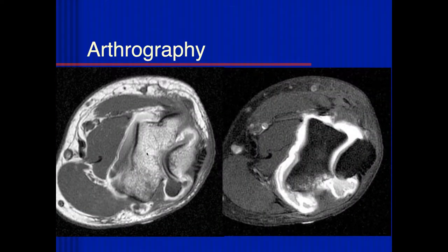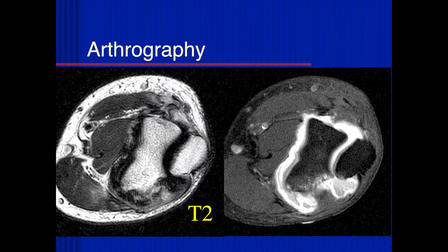This shows an arthrogram. We rarely do arthrography of the elbow, and in my experience I would rarely do arthrography just about anywhere. Occasionally we'll do MR arthrograms of the elbow — maybe you can see the articular cartilage a little bit better — but one of the problems is that if the contrast is too concentrated, then the T2-weighted images aren't very useful.